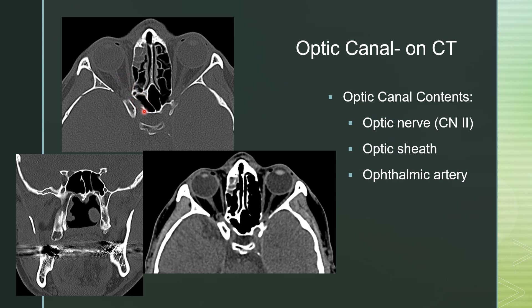Here it is on the right; on the left we're just a little bit out of plane. On the coronal imaging, you're looking for that optic nerve. Here it is again on axial, on soft tissue windows — you're looking for that optic nerve going through the optic canal towards the optic chiasm.